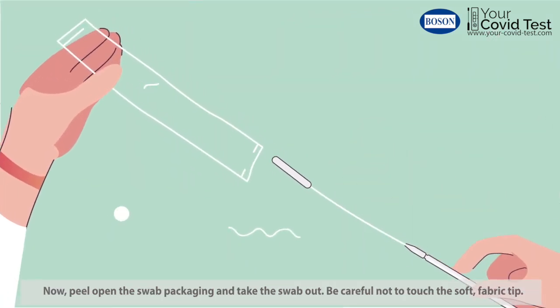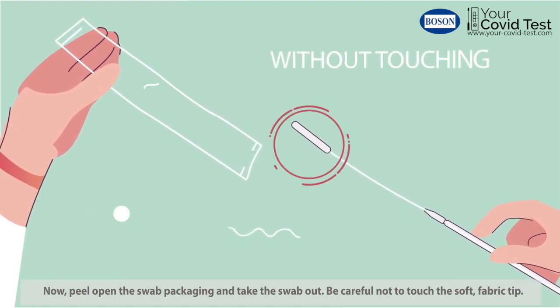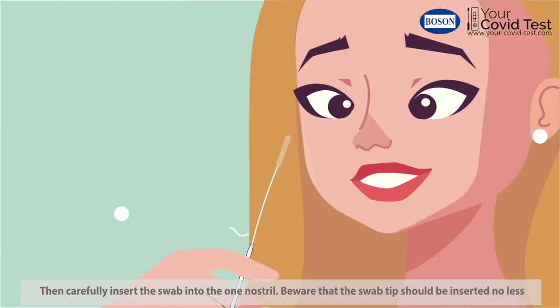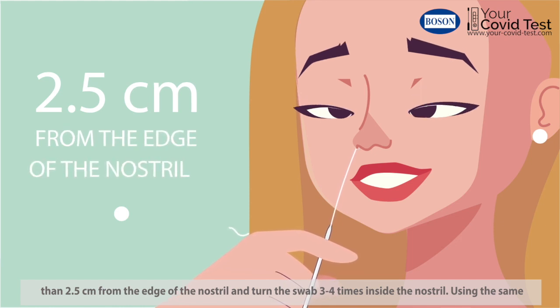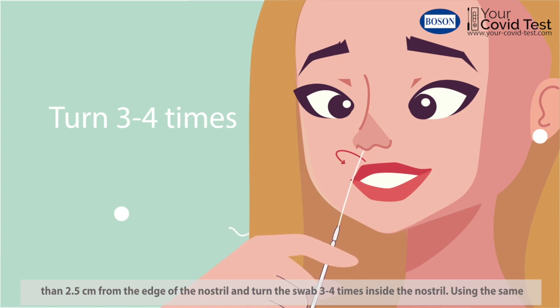Now peel open the swab packaging and take the swab out. Be careful not to touch the soft, fabric tip. The swab tip should be inserted no less than two and a half centimeters from the edge of the nostril and turn the swab three to four times inside the nostril.